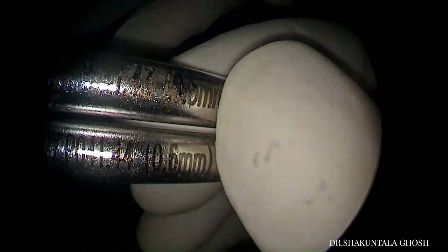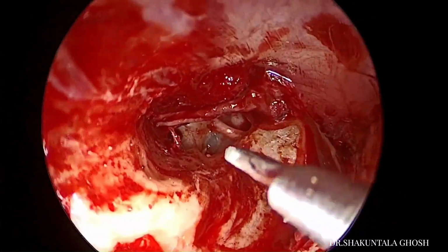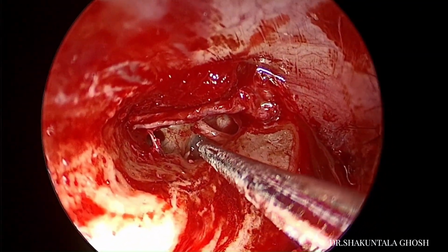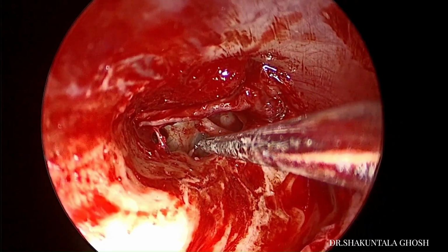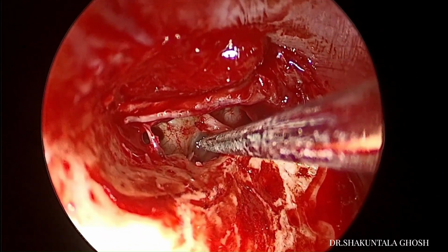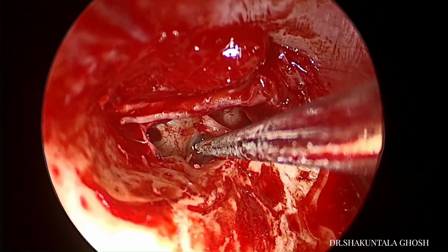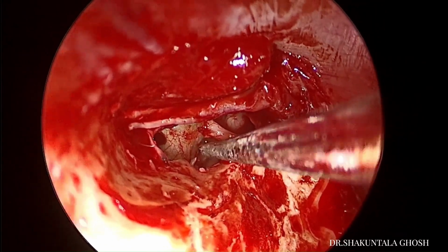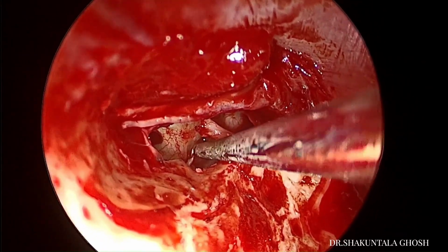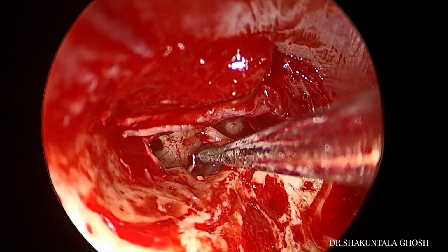the round window. So now I will use a straight pick, 0.5 mm diameter and 0.6. I have got two. So I first take the 0.5 mm diameter straight pick, the perforator, and I will perforate the foot plate in the posterior aspect. One must do it posteriorly because the utricle lies a little away from the foot plate here. Anteriorly the saccule is very close to the foot plate, so one must avoid making an anterior fenestrum which will injure the vestibule.